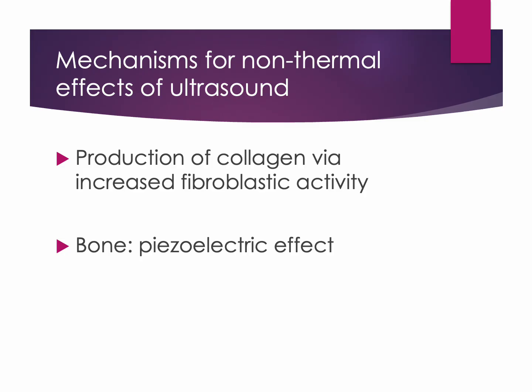As fibroblasts become more active, collagen production may increase, helping support tissue repair in structures such as tendons, ligaments, muscle, and joint capsules. Because collagen provides tensile strength to healing tissue, this process is considered important during the proliferative phase of healing. In bone, non-thermal ultrasound has been associated with stimulation of the piezoelectric effect.